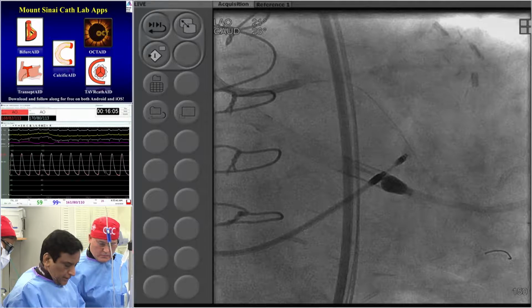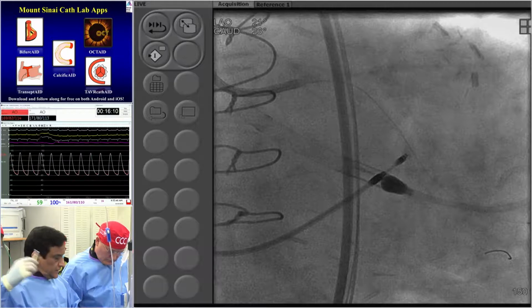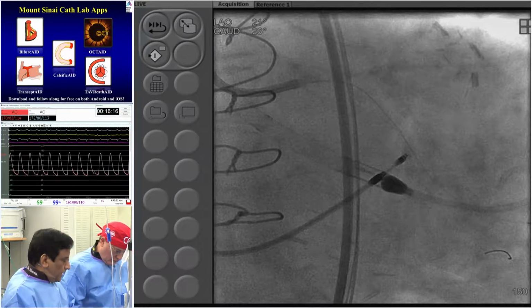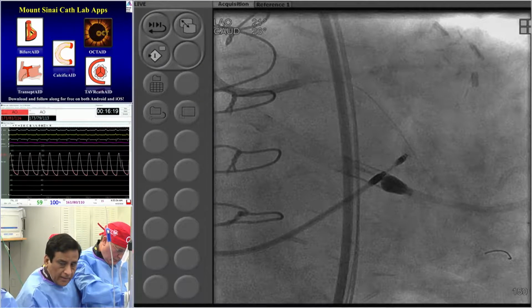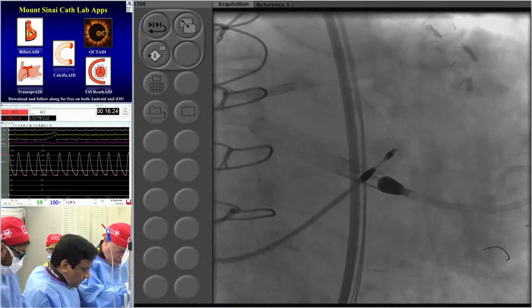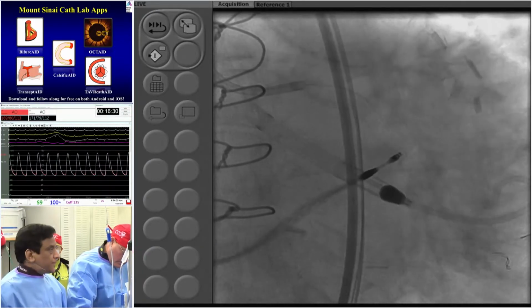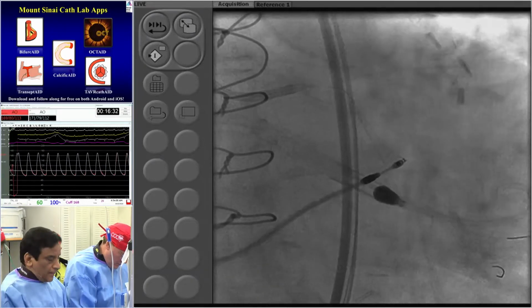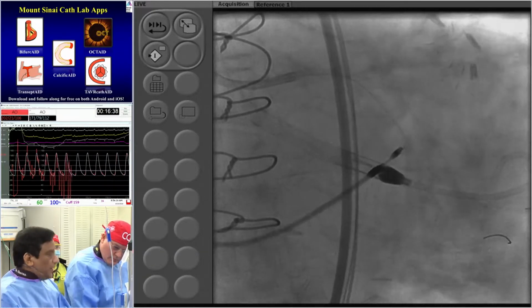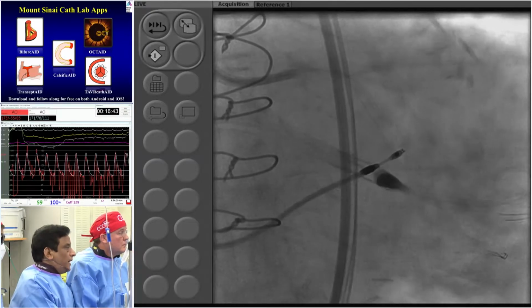Yeah, the question is, remember there is only some data with Disrupt CAD 2 presented. The trial is ongoing at present. The only problem that will remain for all these comparative devices is that there is no comparison. With Disrupt CAD, it's only using the shock wave. The control arm is not atherectomy. And same thing in the Eclipse. They're doing orbital atherectomy, but the control arm is still balloon, not another atherectomy or the shock wave. But as far as the data point of view, I think this one probably will be an okay case with a shock wave, as far as I know from the literature.